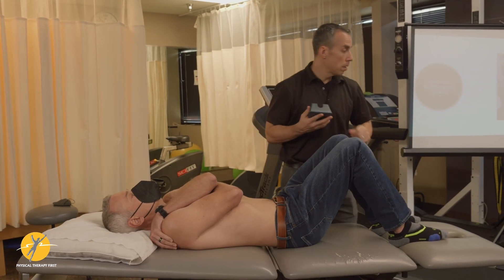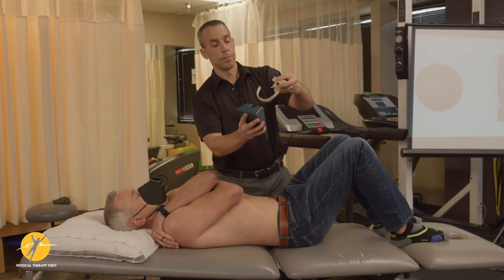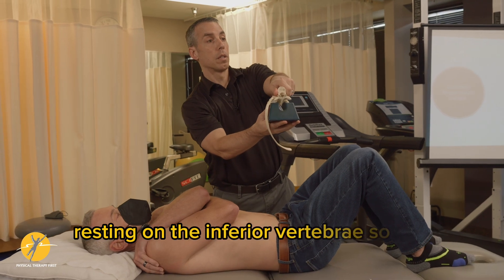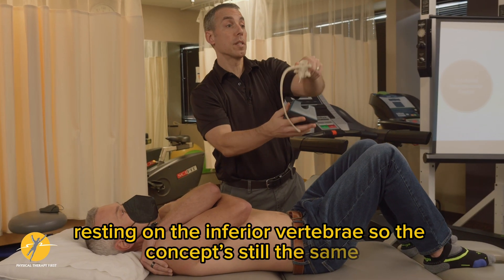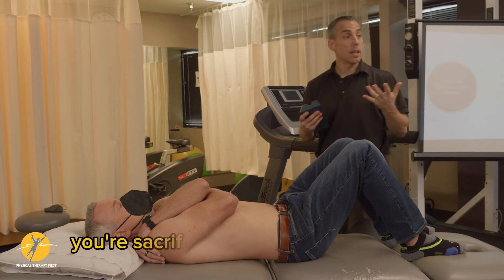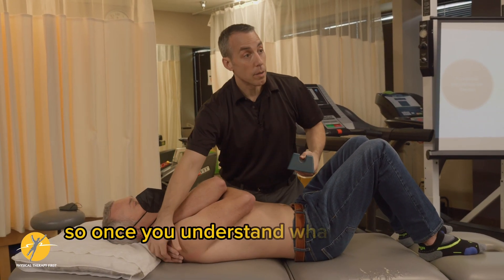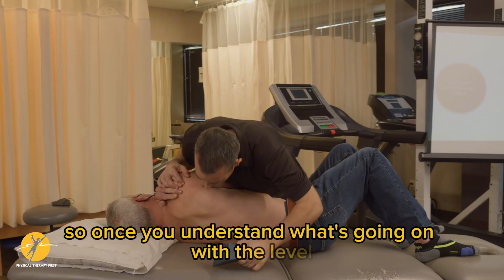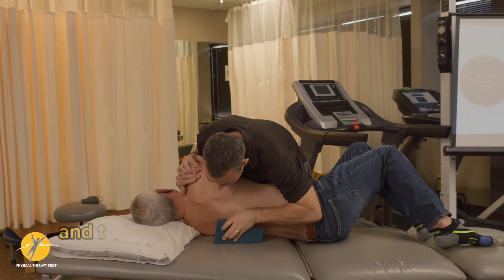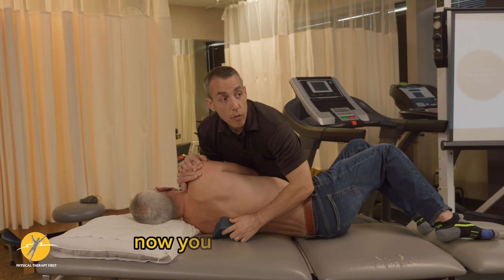You get this part of the wedge resting on the inferior vertebrae. The concept's still the same — you're just saving your hand, but what you sacrifice is input into your system. So once you understand what's going on and you identify the level, you take the wedge and put it there. Now you have a free hand.